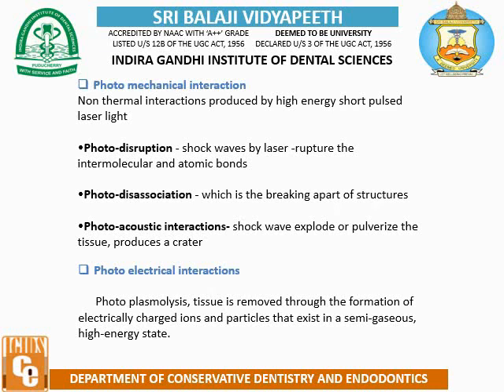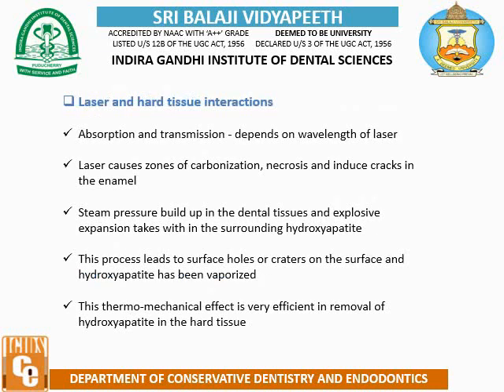Photoelectrical interaction, photoplasmolysis: tissue is removed through the formation of electrically charged ions and particles that exist in a semi-gaseous and high energy state. Laser and hard tissue interaction. Absorption and transmission depends on the wavelength of laser. Laser causes zones of carbonization, necrosis, and induces cracks in the enamel.